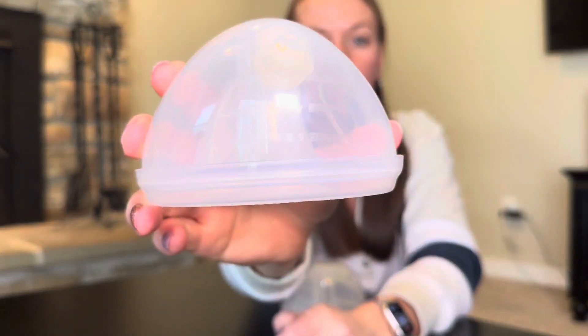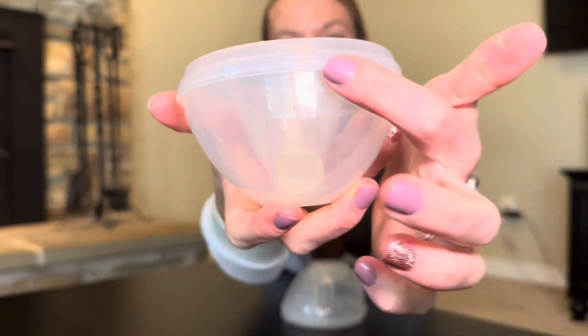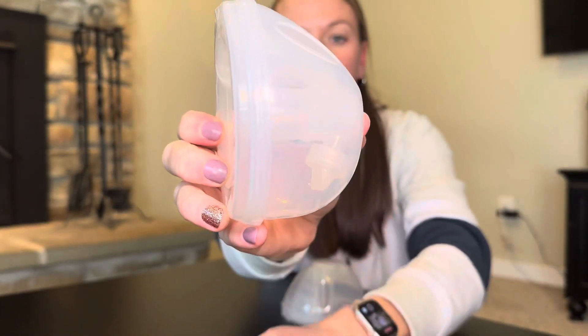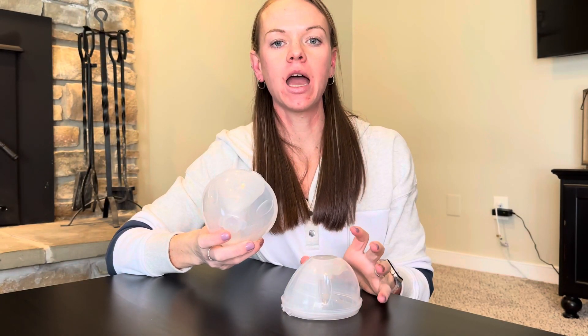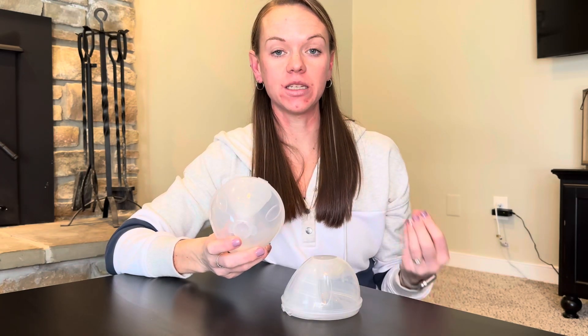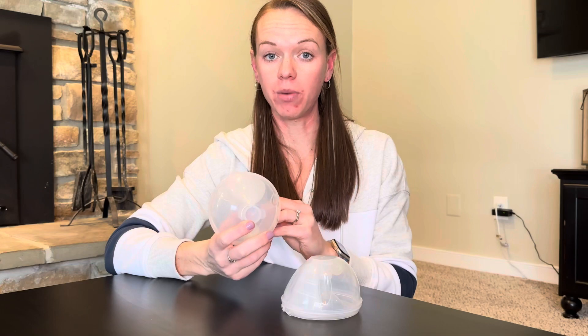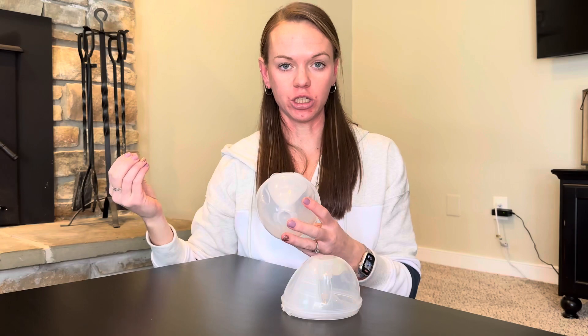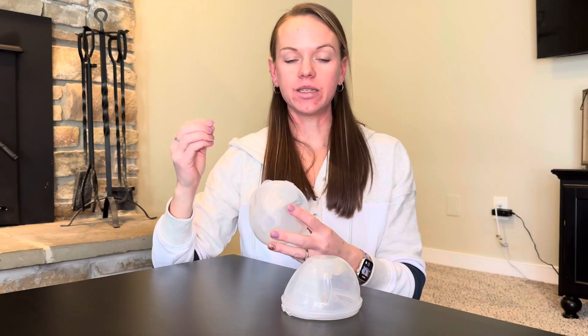There are a couple of different parts where you can measure — down here and also on the side you can measure how much milk is in there. I really enjoyed using these Free Me Cups because I didn't use the Free Me pump — I had another pump. These actually work with a few different pumps, which is really nice. It just depends on your tubing, so I would just check. I was able to discreetly pump without having the big whole contraption set up.